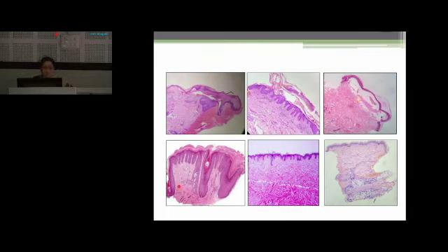In the 7th pattern, inflammation is limited to follicle and perifollicular region. In the 8th pattern, again there is increase in the collagen or fibrous tissue in the dermis. And last, the ninth pattern is panniculitis. We can see that the inflammatory infiltrate is involving subcutaneous fat here.